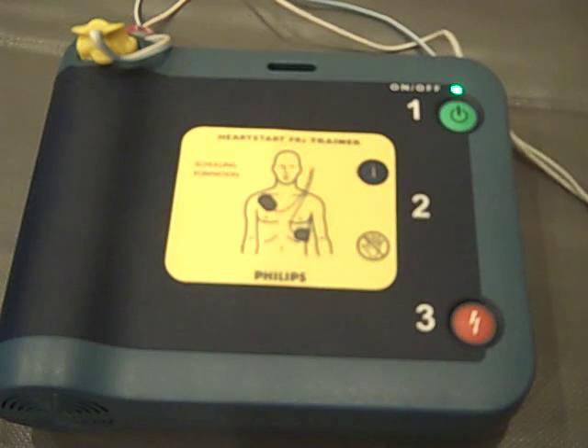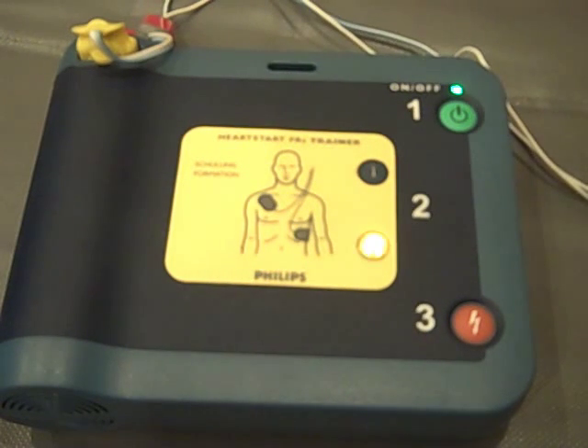Stay clear of patient — analyzing heart rhythm. Shock advised. Stay clear of patient. Press the flashing orange button now. Shock delivered.